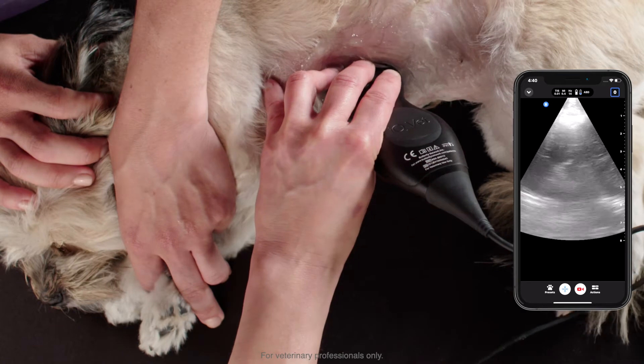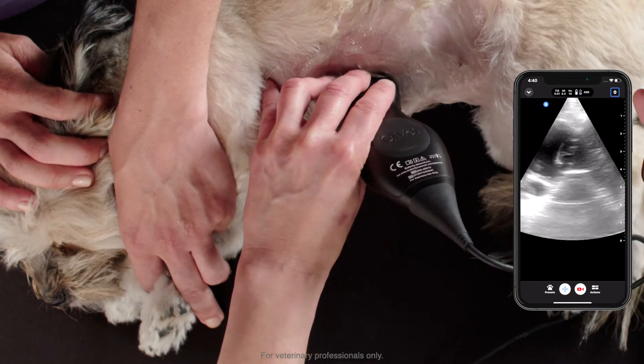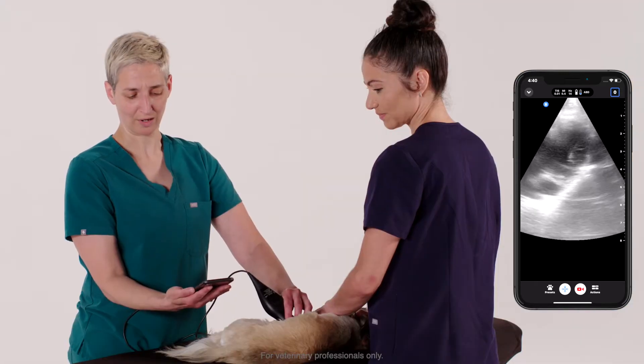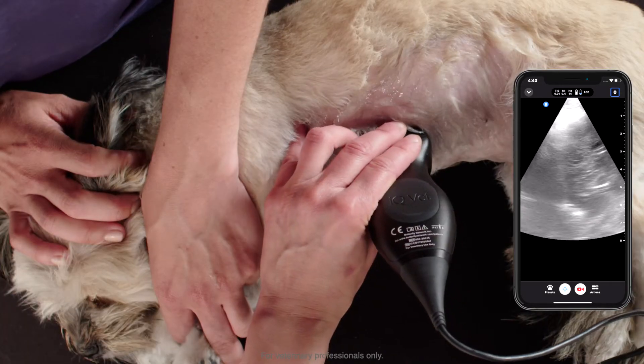We can orient a little bit cranially to examine the heart beating. I'm looking for any pericardial effusion or any evidence of microcardia that might indicate hypovolemia.